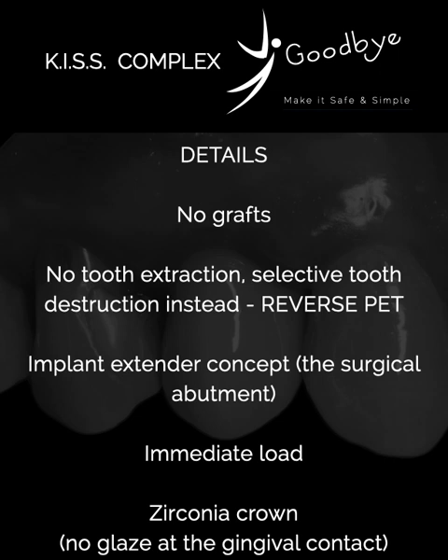You should never glaze the gingival contact, and we'll go through this in a lot more detail. So that's the main goal of this group: being safe and simple, and enhancing your clinical practice with that.